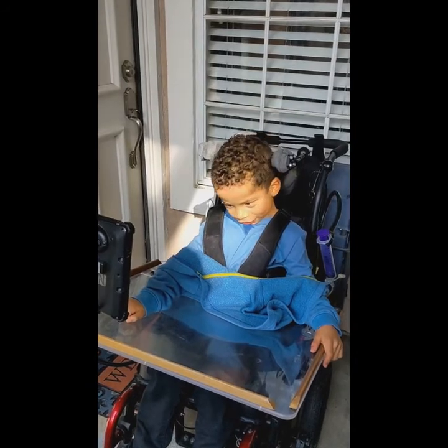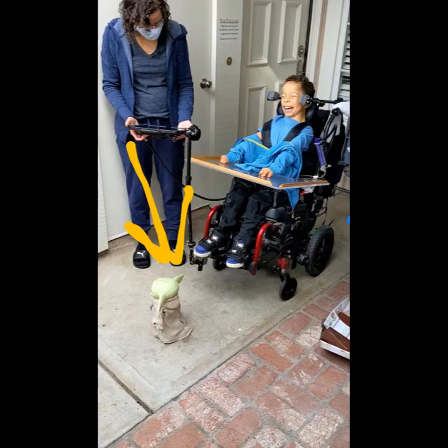Basketball. Yeah, awesome. We just saw how Tyler can use his two switches to control his communication device for talking, but another awesome thing that he gets to use his communication device for is to control any device that is operated by an infrared remote control. The most common devices controlled by infrared remotes are televisions, but as you're about to see, some toys are also operated by infrared remotes. This is important because Tyler's cerebral palsy limits his ability to hold a remote control and push the buttons himself. So his communication device is able to learn the signals that a remote control sends out and have those signals programmed onto a screen that Tyler is able to control with his two switches.